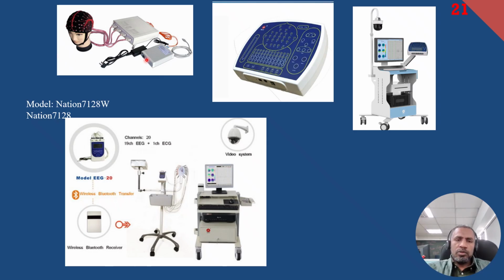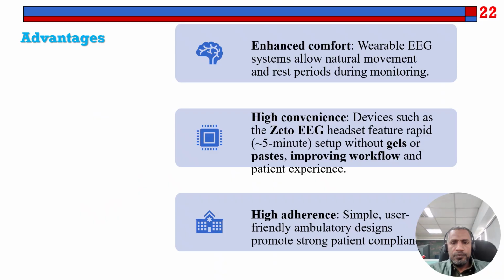There are also different brands and different types of EEG devices. These devices we can easily get in the market.